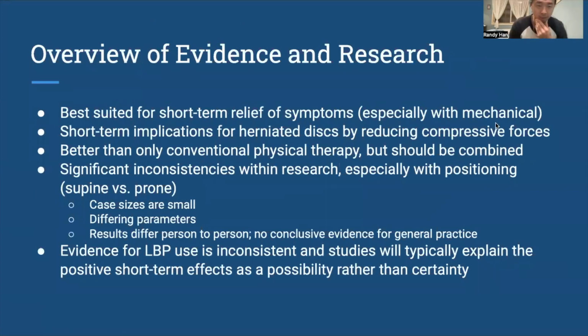All right, going back to some of the recent research that's been coming out lately. Again, it's pretty similar to cervical traction. When it comes to lumbar traction, it's mainly used for short-term relief of symptoms. There are a lot more short-term implications for things like herniated discs, because you're reducing those compressive forces.